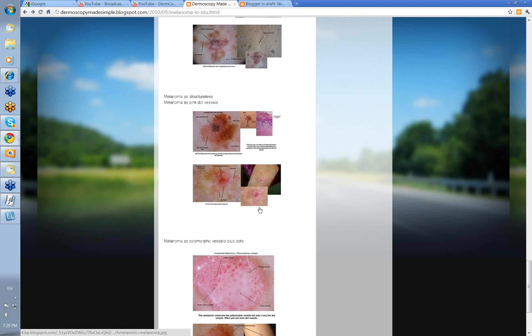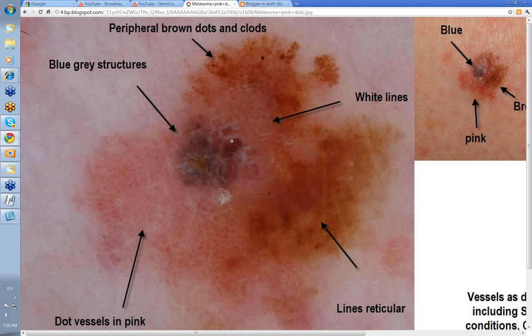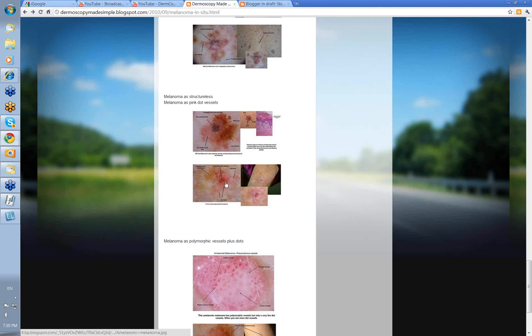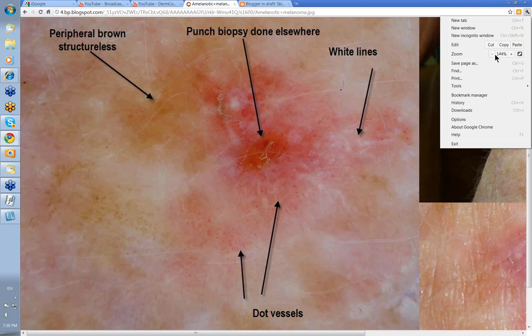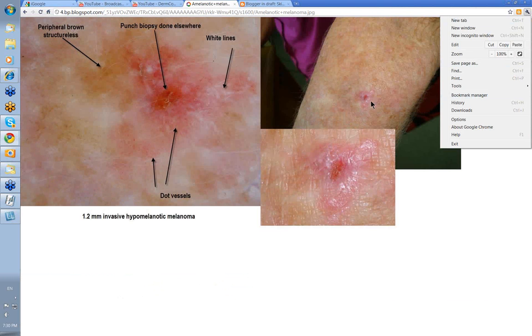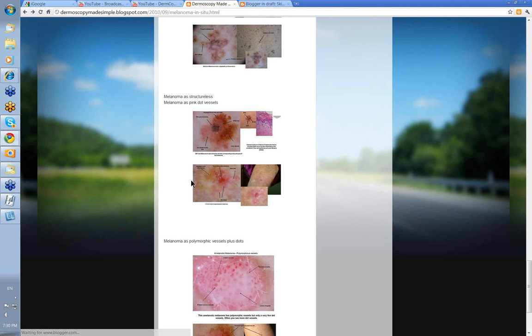And to finish off — melanoma with pink dot vessels. This one here corresponding to this area: blue-grey structures, peripheral dots and clods, perhaps some white lines within this, and lines reticular in this too. But it's dot vessels in a pink area that would have you thinking of certainly melanoma. And this is another one that's perhaps even more subtle — a lesion on the forearm. Someone already done a punch biopsy. I think there's some white lines in this, there were some dot vessels here, a little bit of peripheral brown structureless area as well. A hypomelanotic melanoma.